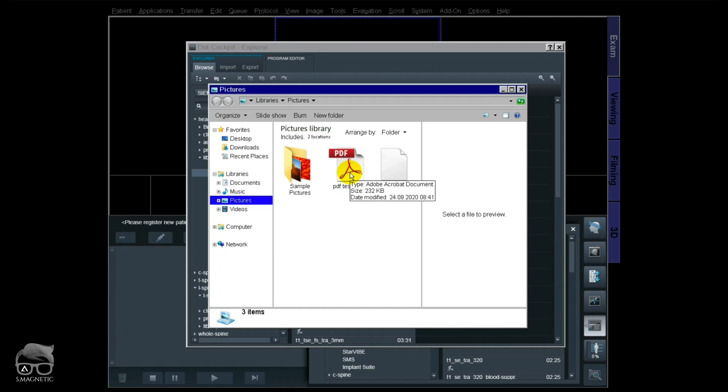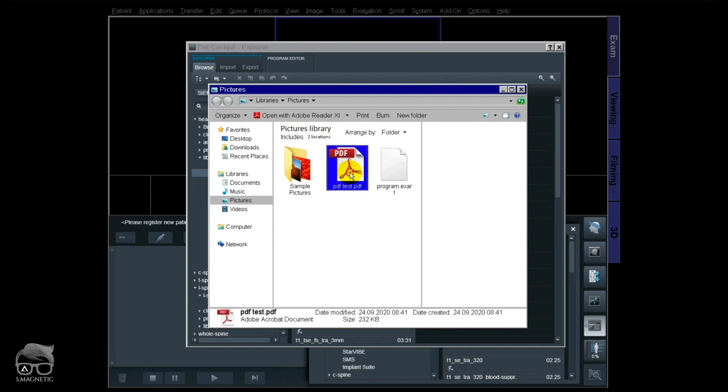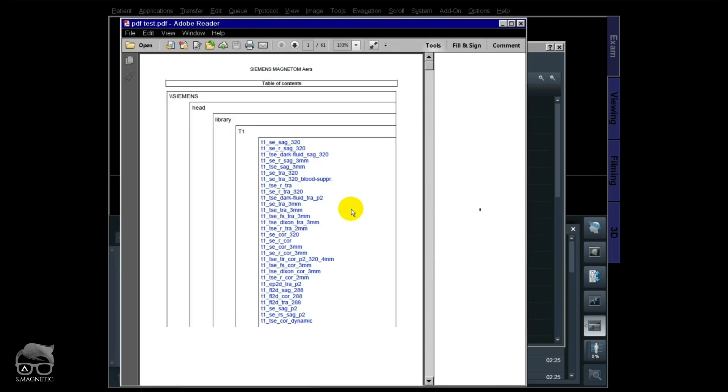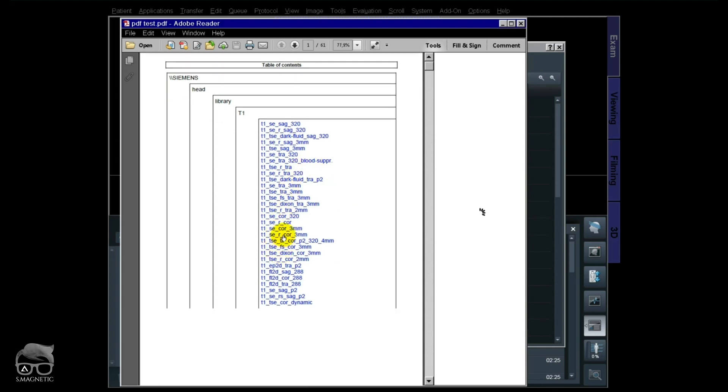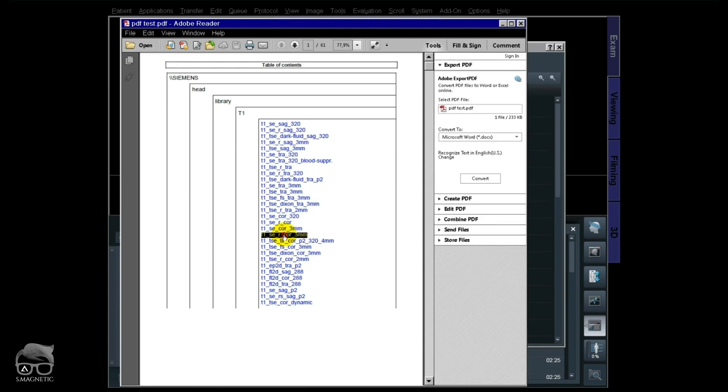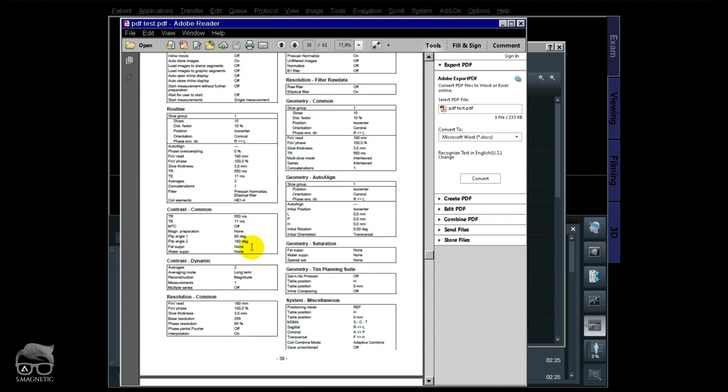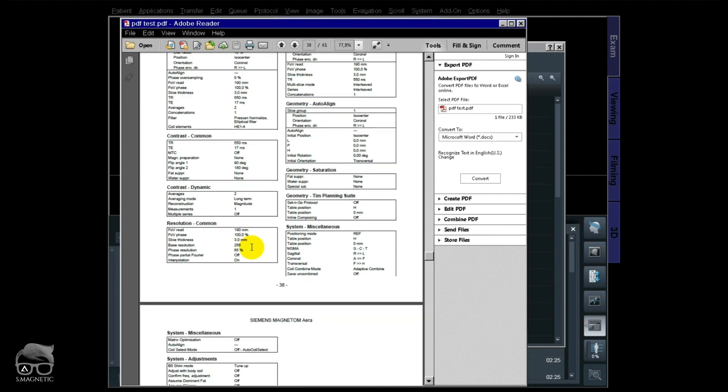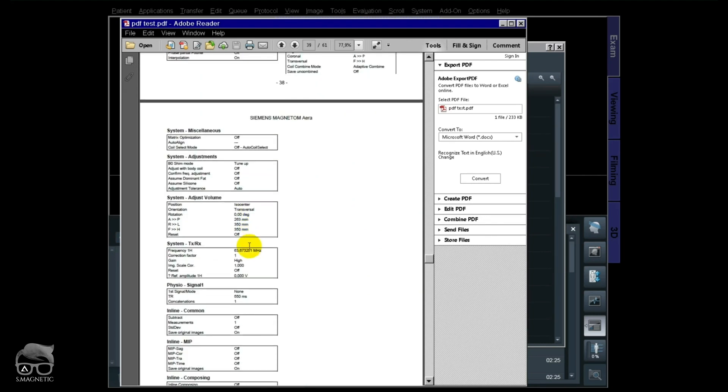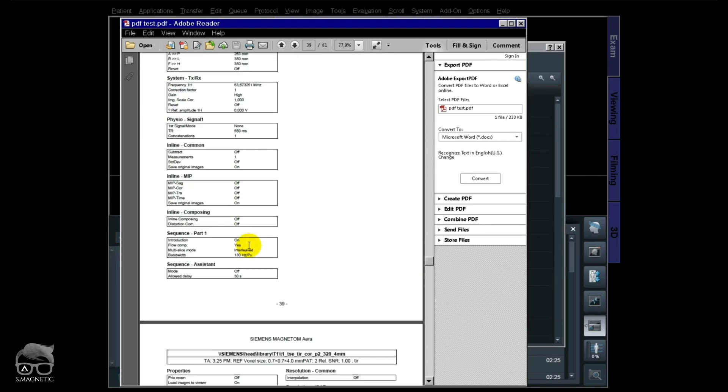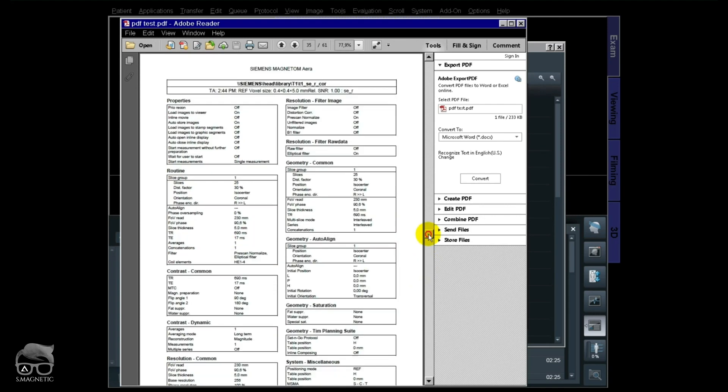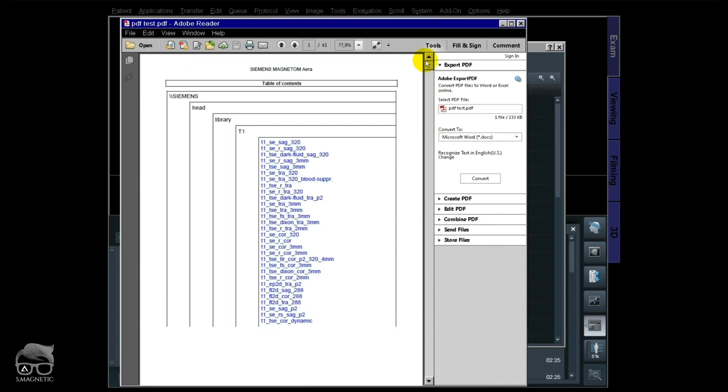So let's go and check that file. Because the table of contents is on right there, it makes it faster for you to scroll through and choose the sequence you want to check. Let's just choose this one. There you go. There you have all the information on the sequence. You have the TR, the TE, the flip angle, everything which gives you possibilities to create the sequence. Let's choose another one.